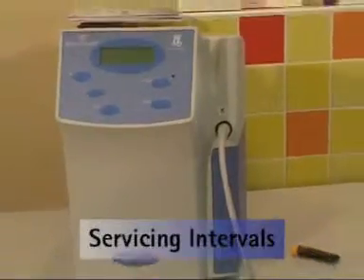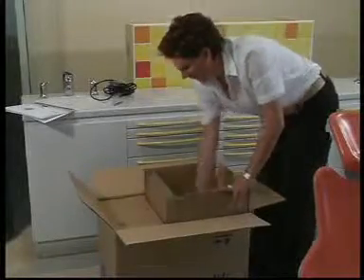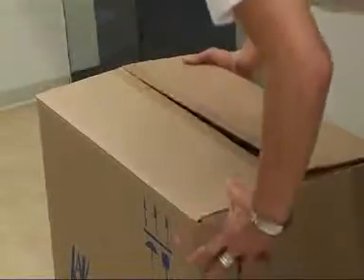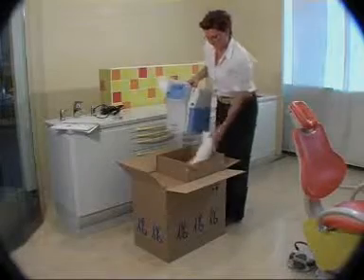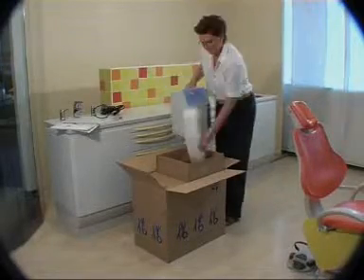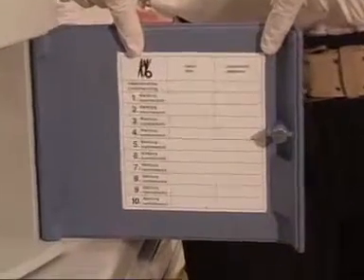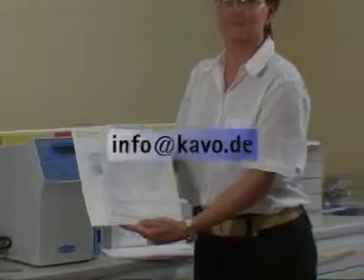Servicing intervals: your HELOzone unit must be professionally serviced once a year. In some countries a collection service is offered, meaning that your unit will be collected and returned to you as soon as possible. Please check with your dental dealer or the subsidiary how this is handled in your country. An up-to-date servicing record is located on the interior of the unit's door. For more information, please contact the KaVo after-sales service team or send an email to info@kavo.de.